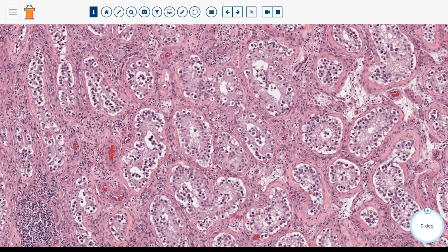And so this entity, the name has been changed in the most recent WHO classification. So in the 2016 WHO classification of testicular germ cell tumors, the name for germ cell neoplasia in situ was changed. That was to accommodate basically the two different schools of thought for this entity. In the previous WHO classification, it was referred to as intratubular germ cell neoplasia unclassified, so that was often abbreviated as IGCNU. And other pathologists, especially those in Europe, often use the term carcinoma in situ for this entity.